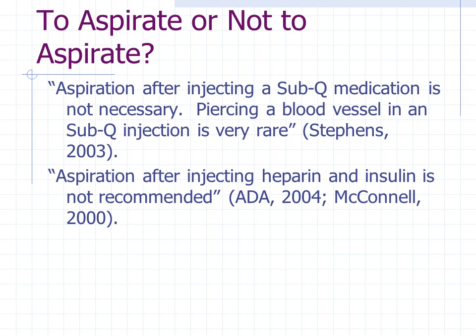To aspirate or not to aspirate. When you're doing a subcutaneous medication, it's not necessary because piercing a blood vessel is rare in subcutaneous tissue. But you definitely should aspirate with your intramuscular injections. Aspirating after heparin or insulin is definitely not recommended.